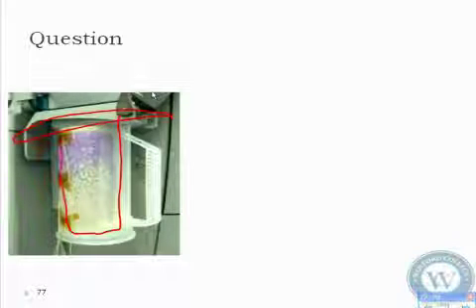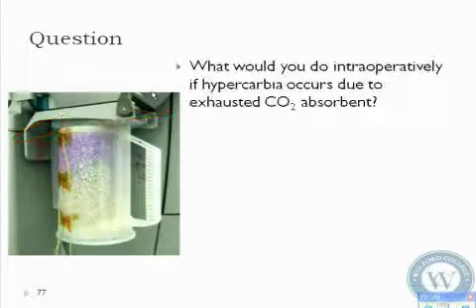This is the newer type on the Apollo that you'll see. This thing comes just like that, okay? So you can get some that come with the handle on it or with this one. This actually just houses a canister that sits down in this. So you'll simply pull off the top of it at that point, drop it in, and just plug it. But with this one, you can change this in the middle of a case. And you will not lose pressure in the system, okay?